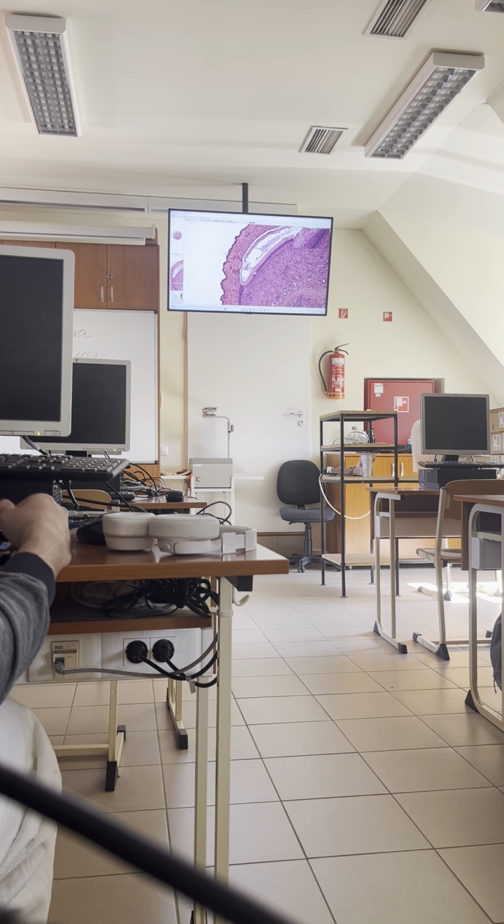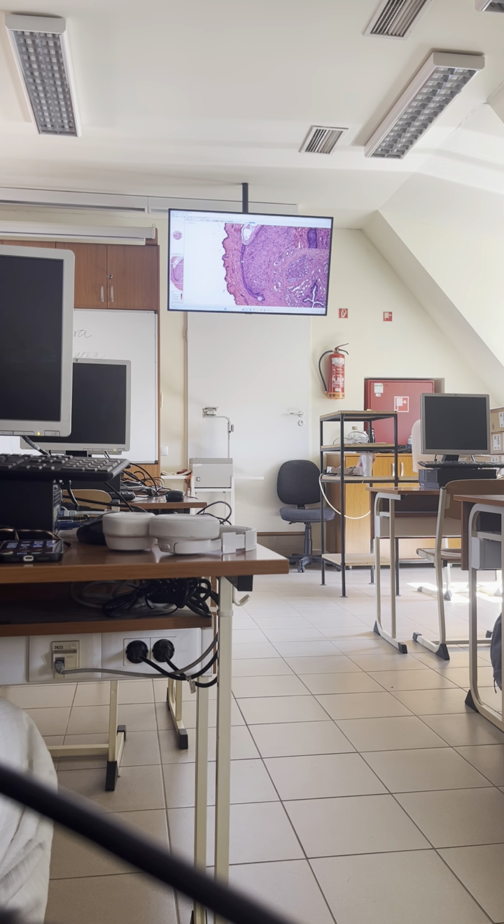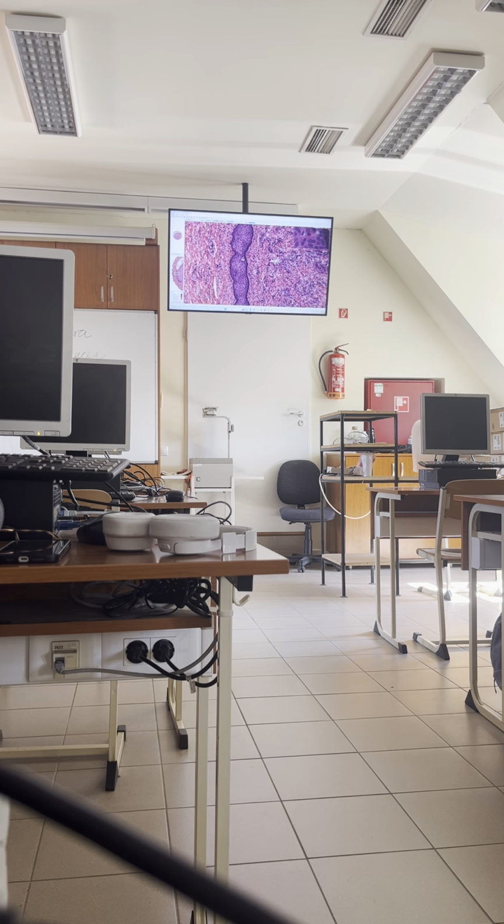At the territory where the phimosis still exists, like here, in this territory of the fusion, what we can see is nothing more than here one stratum basale, one row of cuboidal cells, and another row of cuboidal cells, another stratum basale.